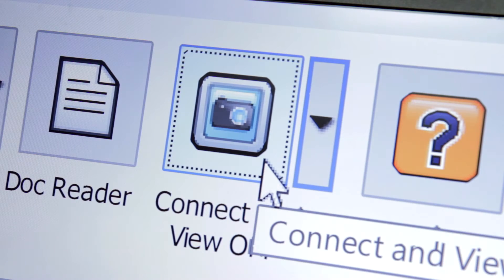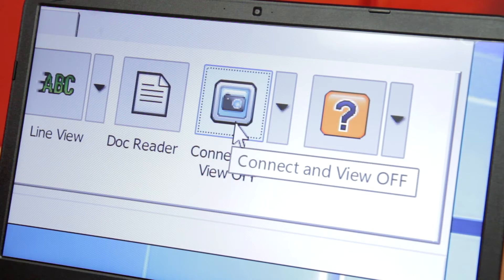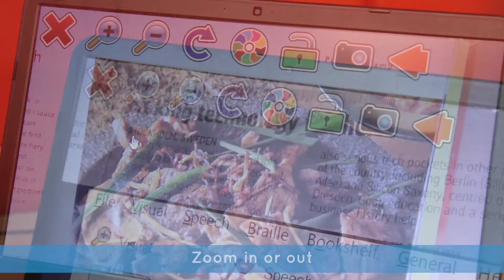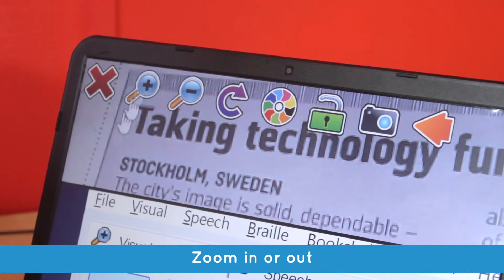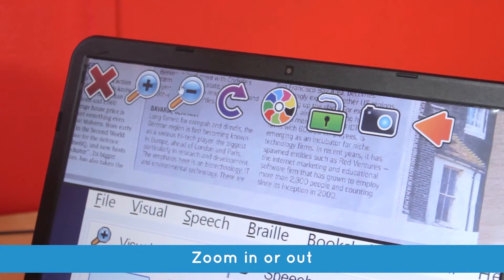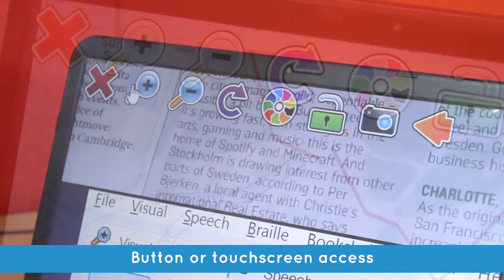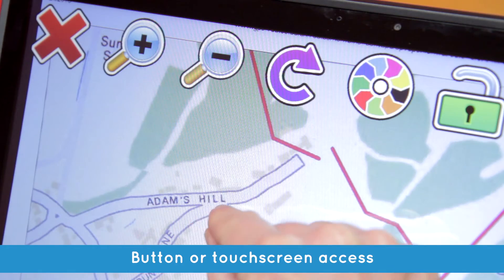Click on the Connect and View button and Supernova instantly magnifies whatever you place under your camera. Zoom in for more detail or zoom out for an overview. With Connect and View, you can use the convenient buttons, or touchscreen users can pinch to zoom.